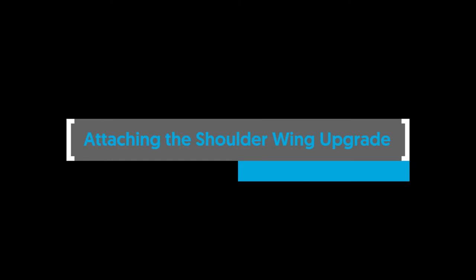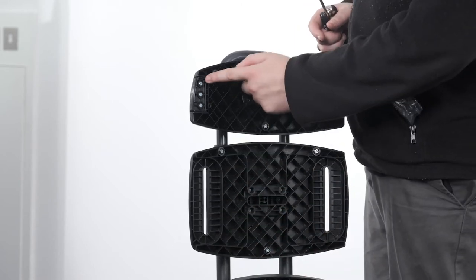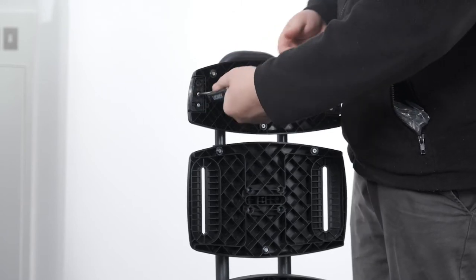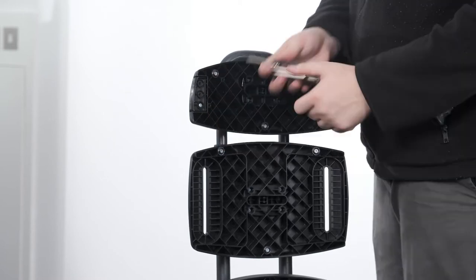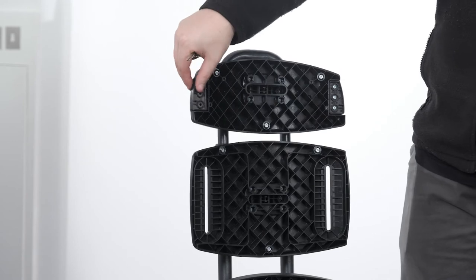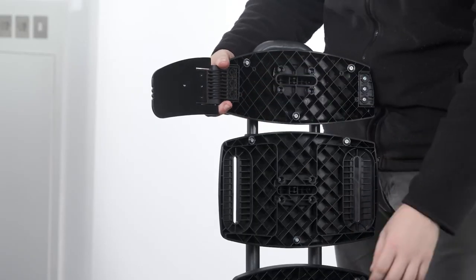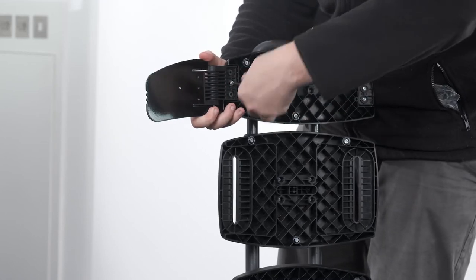Attaching the shoulder wing upgrade — moderate backrest only. To attach the shoulder wing upgrade, the shoulder blank moulding must first be removed by unscrewing the three screws holding it in place using the Allen key. Remove the shoulder blank moulding and replace with the shoulder wing upgrade, ensuring that it is orientated so that the head of the bolt is pointed upwards. Secure in place with the three screws using the Allen key. Do not over tighten.